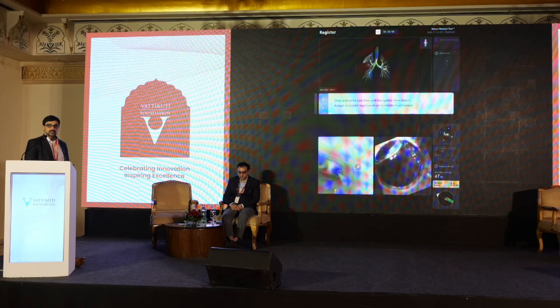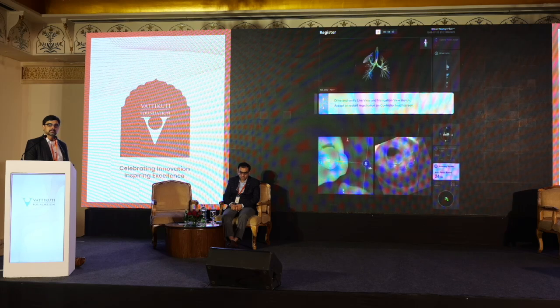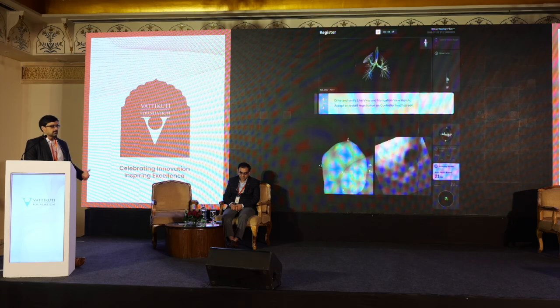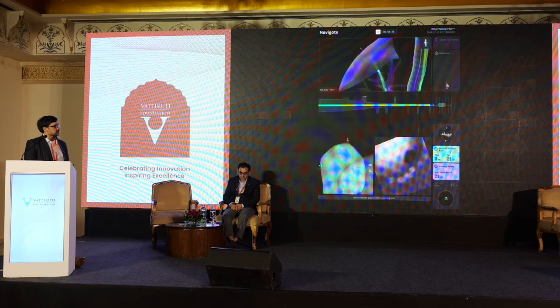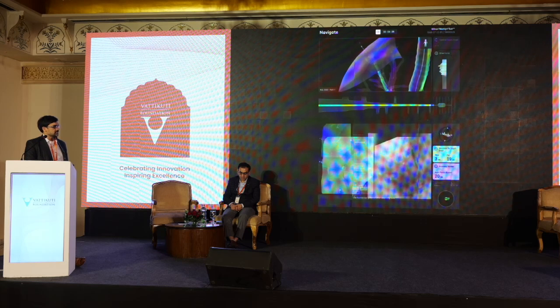You just follow the blue line, and if you follow the blue line, you'll end up at the green mass, which represents the site of the mass and where you need to take a biopsy, or in this case, place the fiducial. It's confirmed with the map on the top as well, and you can see all the measurements that are provided.